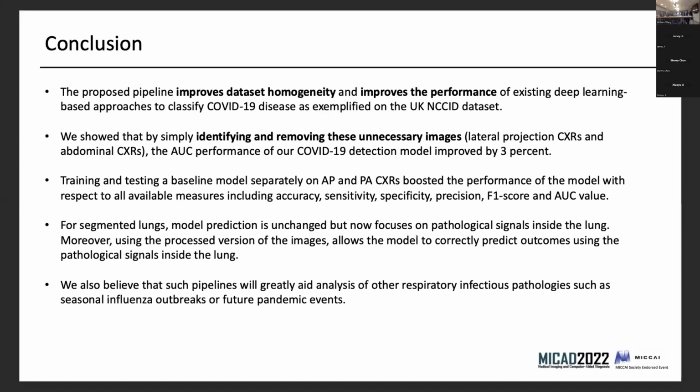That's exactly right. So for our segmentation model, we based it on another researcher's work, and fortunately they have quite a cool model. There's a paper, but they used a COVID chest X-ray data set, which actually had these kinds of areas of ground glass opacity. They shared that data and we trained on it. They also have a very interesting encoder architecture to impute data and handle observations to achieve some kind of representation of this part of the lung, which is usually mistaken. So we saw quite good results in that model. It wasn't perfect, obviously.